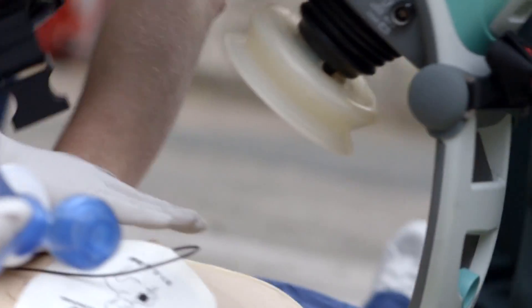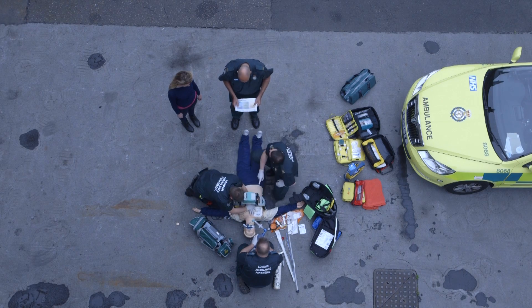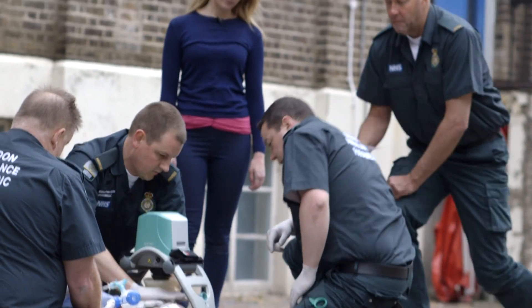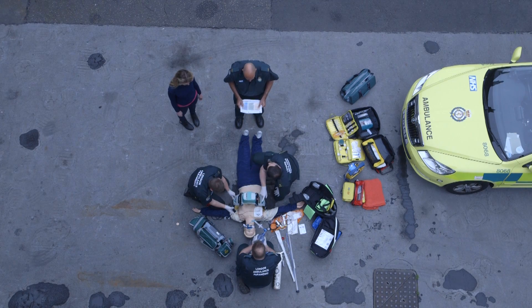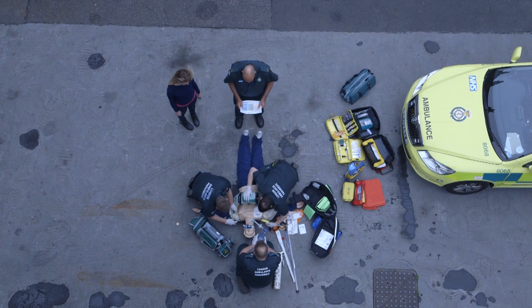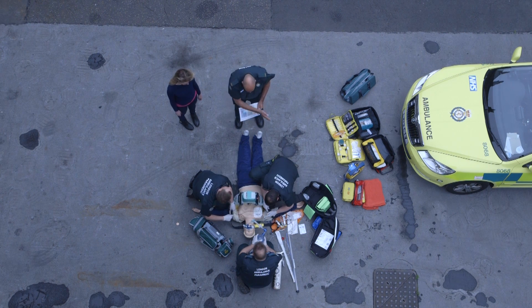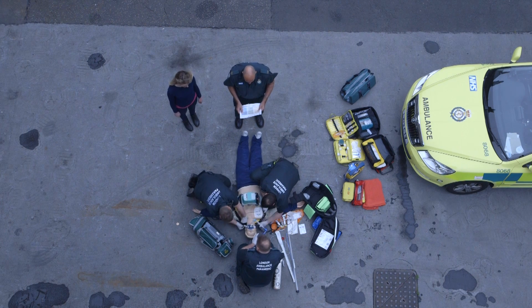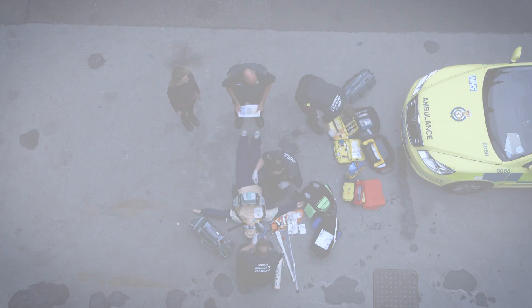We've still got a box waveform which would indicate the ET tube still in situ. Chris, I'm going to come between your arms with this — don't stop CPR. Mick, can you confirm that's in the centre of the patient's chest? Yes, I'm happy. Chris, can you just pause CPR for a minute? I'm putting this on continuous because we've got an advanced airway. Chris, can you event mark that and turn off the metronome, please? I'll ventilate to the mechanical device. Chris, once you've done that, can you get me an adrenaline ready, please? Mick, we have a slight rise in tidal CO2 — it's 2.7 kilopascals now, with a lovely box waveform.